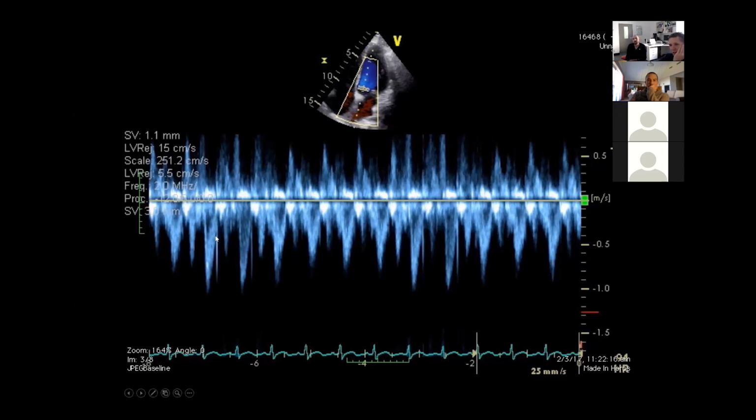So if you look here, we've got a closing click. We lose the closing click when that patient starts to breathe. You've got a three-dimensional structure, which we're assuming you're right down the gun barrel of. As that patient breathes, that gun barrel can move.